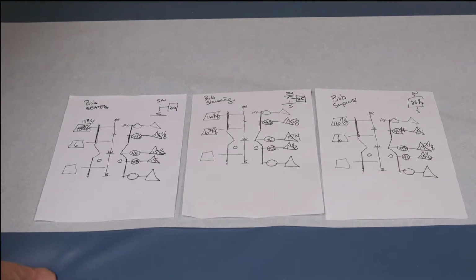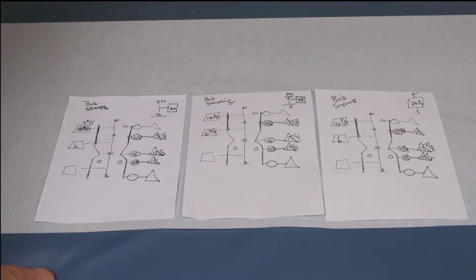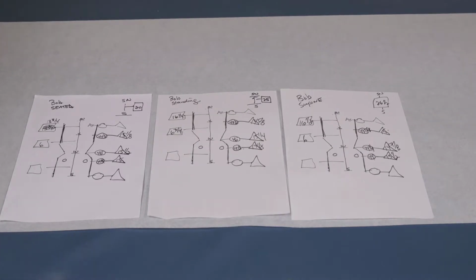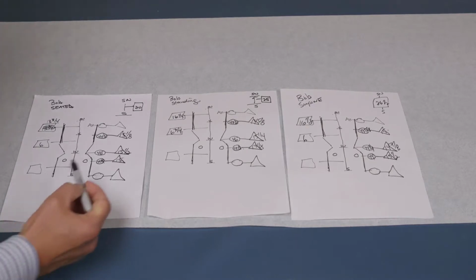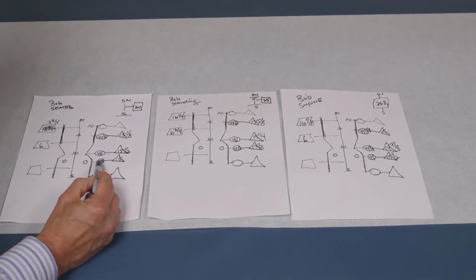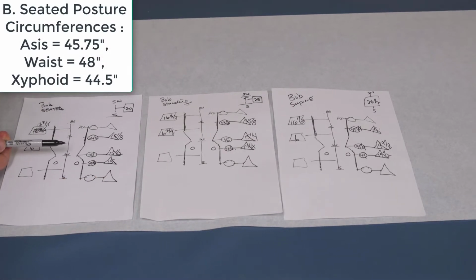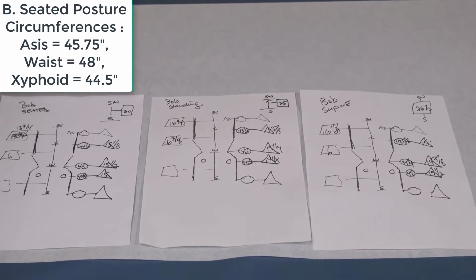So let's analyze our diagrams. This is Bob's seated picture, and the measurements we could take of Bob in the seated posture were the circumferences at his ASIS, his waist, and his xiphoid. The MLs we could also take. Okay, so this number says 45 3/4. That's the ASIS. The waist is 48. The xiphoid is 44.5.